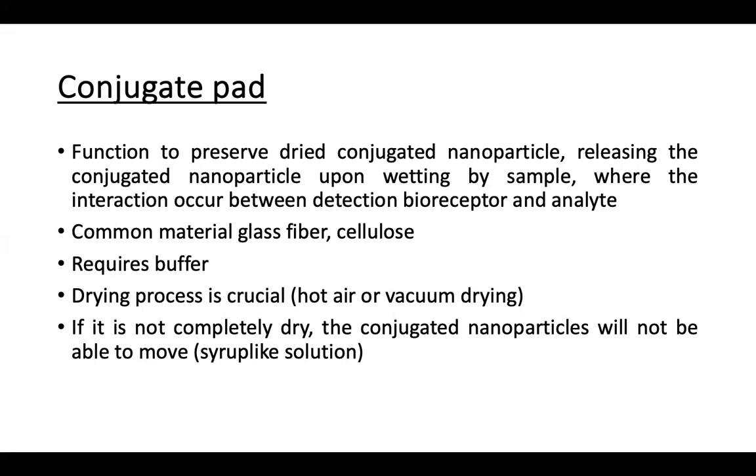If there is something wrong with the lateral flow and it doesn't move, then you have to check whether there is some damage or probably a blockage on the lateral flow. So this also requires buffer sometimes. The drying process is very crucial. If it is not completely dry, the conjugated nanoparticles will not be able to move, and you will end up with a syrup-like solution.